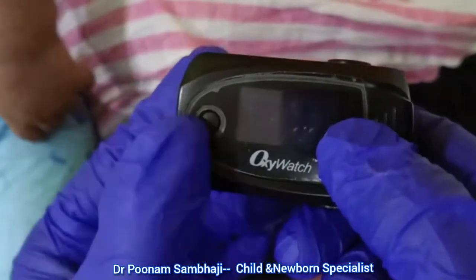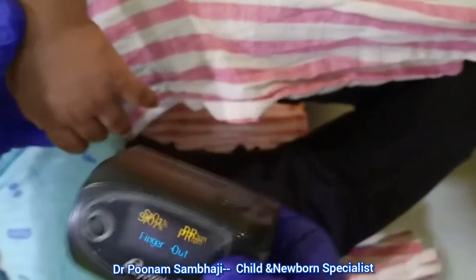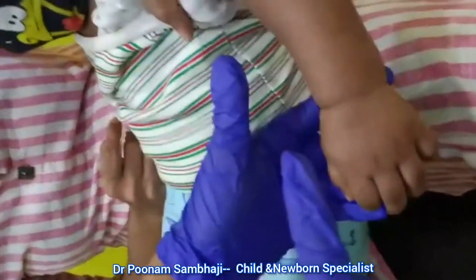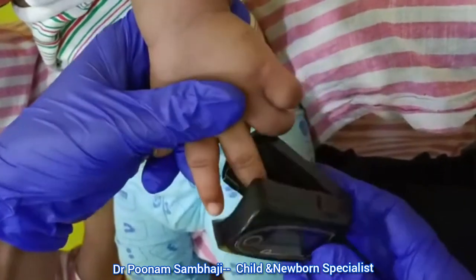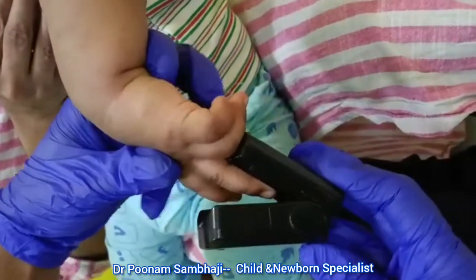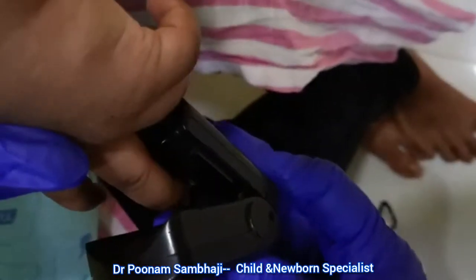Now, this is the pulse oximeter. This is the start button and this is the screen. Once you put it on, you will get some numbers like this. In babies, you are going to use the longest finger, that is this middle finger, because that is what will reach this sensor. Now you can see that sensor over there. I'll show you from close by. Now that is the sensor.